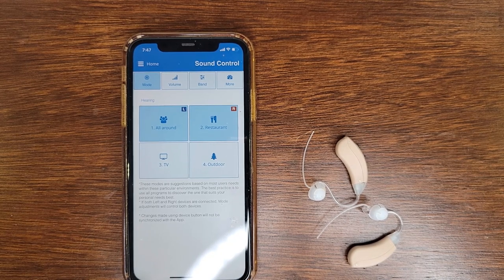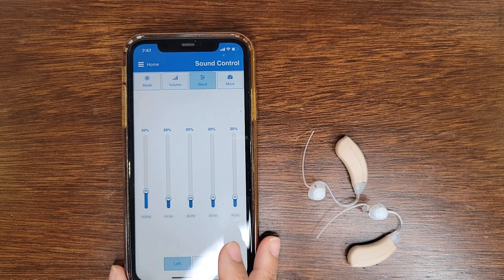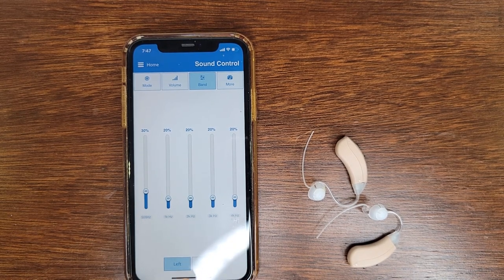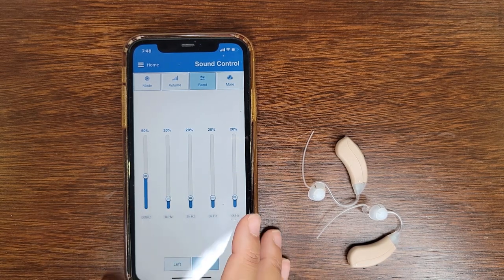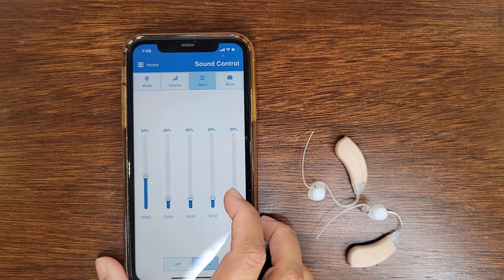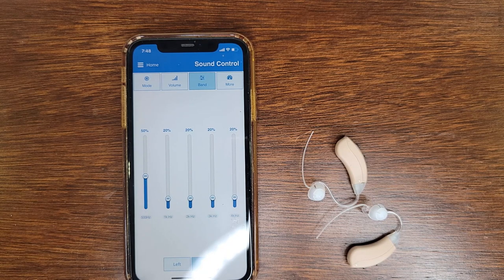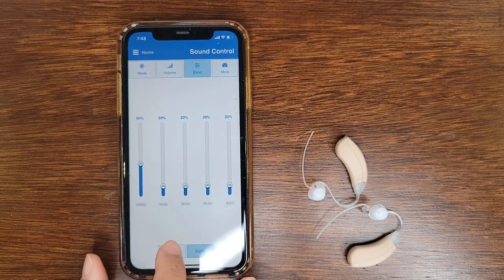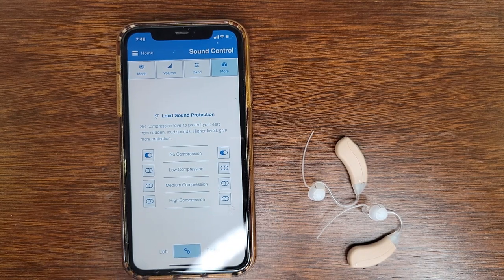Now let's look at our band tab. So this is our band tab, and these are my settings for the left, and let's check out the right. So these are my settings for the right ear. This is what you get based on the test, but you're able to manually adjust that as well. And then let's click on more.